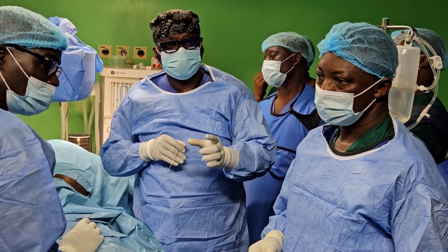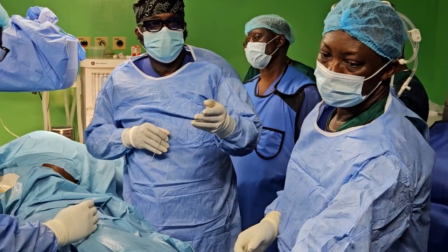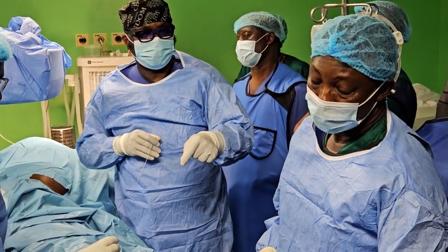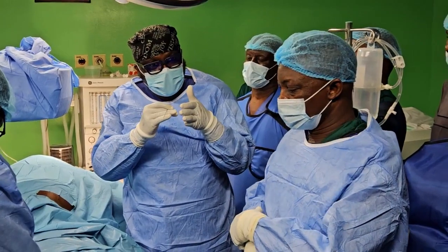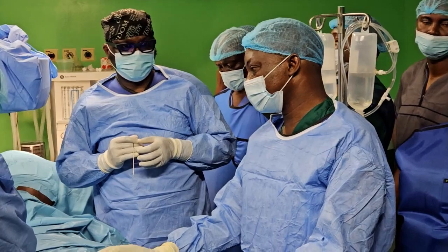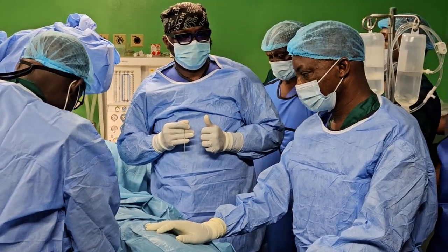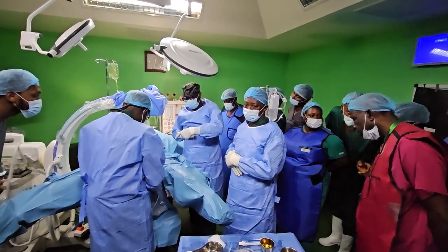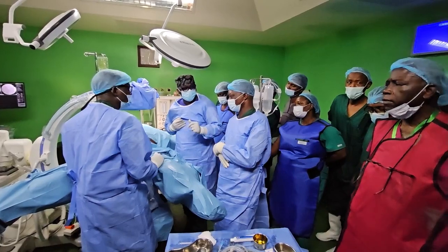But if you started initially with a very light contrast, you can add more and reconstitute a thicker contrast, so that if you now pass that, it will opacify the pelvicalyceal system within that blurry background. You will see a thicker shadow within the blood shadow. That has happened to me about twice, and with passage of a thicker contrast, we were still able to go ahead with the procedure.